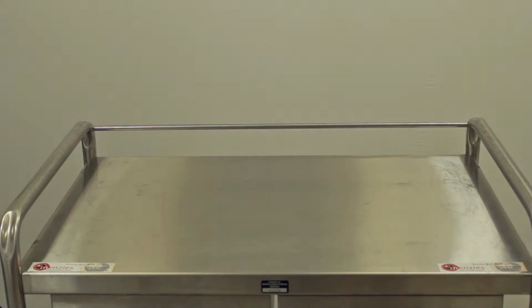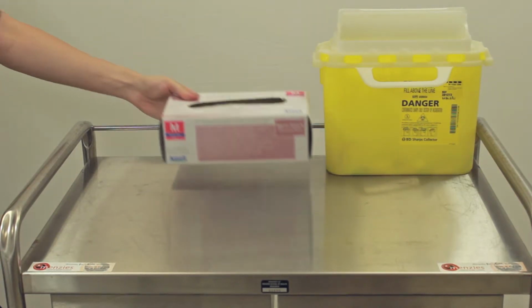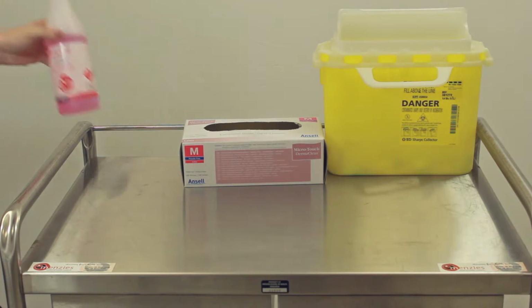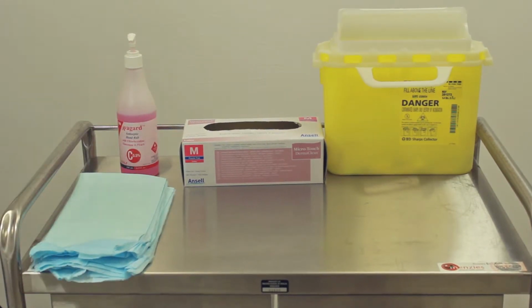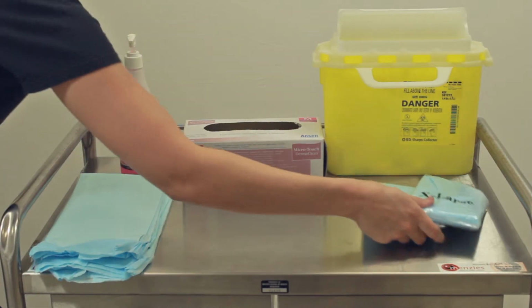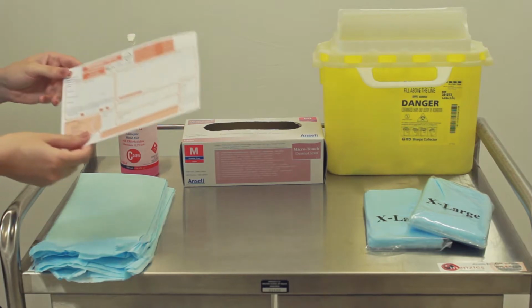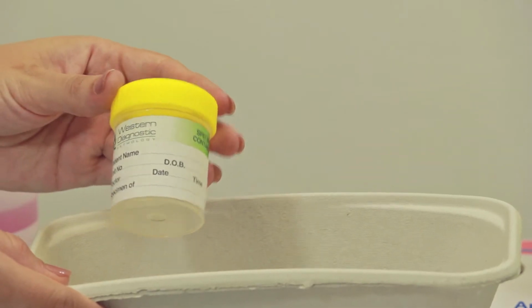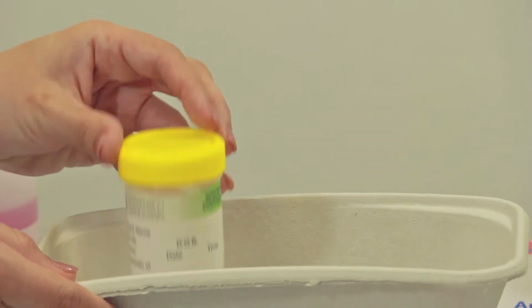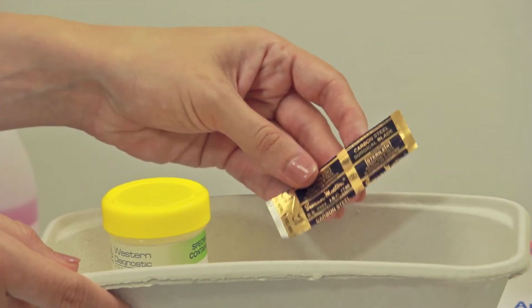Equipment required for the skin scraping procedure includes sharps container, gloves and alcohol-based hand sanitizer, disposable bluey, apron if skin precautions are required, relevant pathology paperwork, yellow top specimen container, and a clinical scalpel blade.